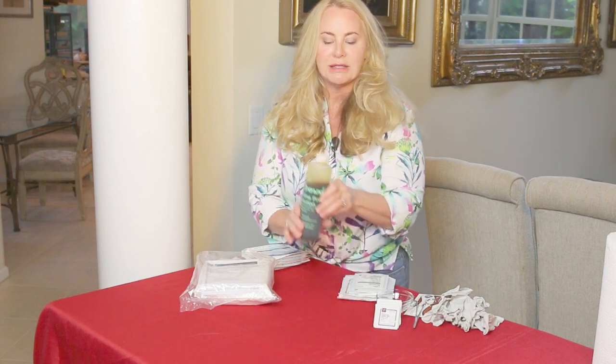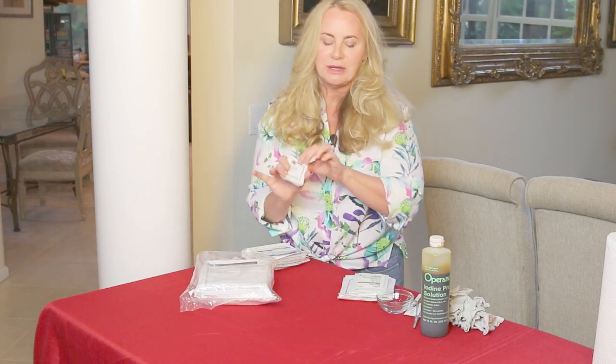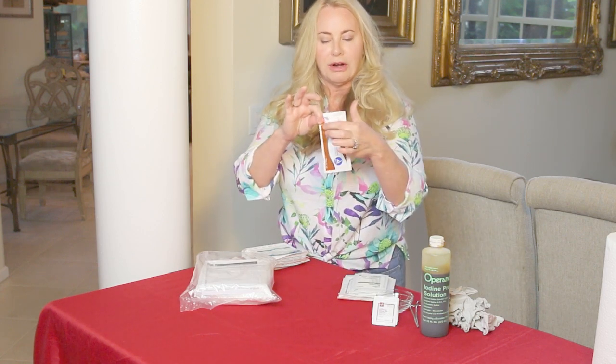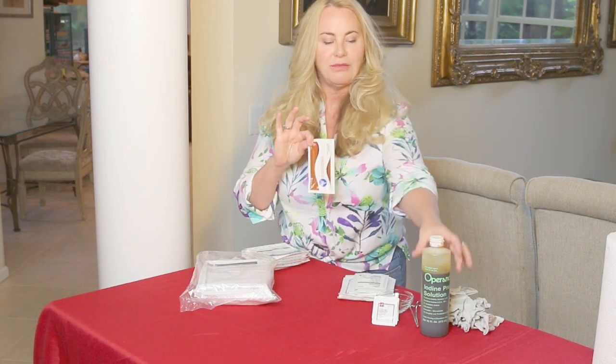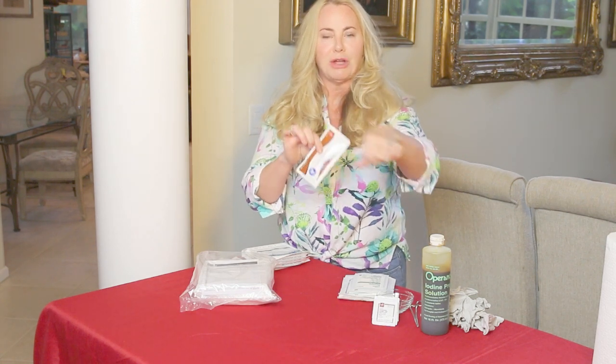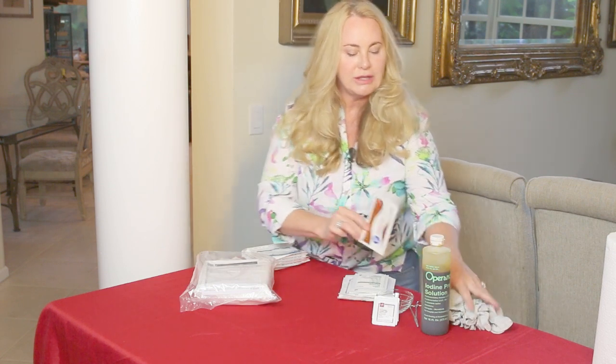For the prep, there's a few things you want to have. You want to have some form of an antiseptic — it could be betadine, it could be Hibiclens, it could be a number of things, whatever you happen to have. What we have here today is povidone iodine, and that's a 10% solution, and it gives you 1% available iodine. Same thing goes for the prep wipes — same actual solution. We also have something called a swab stick. There are three of them inside, they look like giant Q-tips, and they actually have some of the povidone iodine solution inside this sterile packet. That's handy because you're just going to be able to open that up, and with your non-sterile gloves, you'll be prepping the patient.